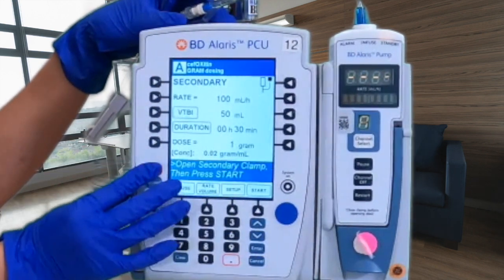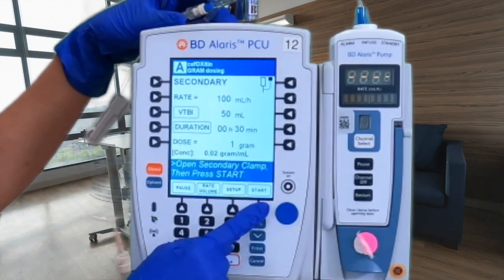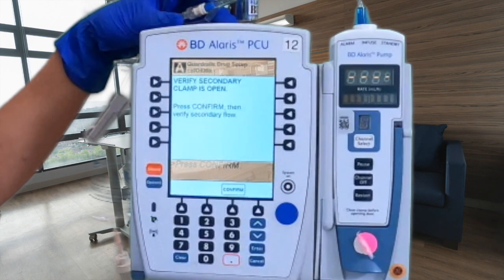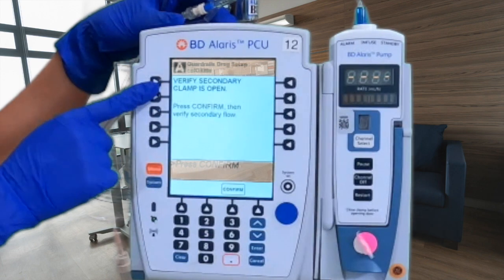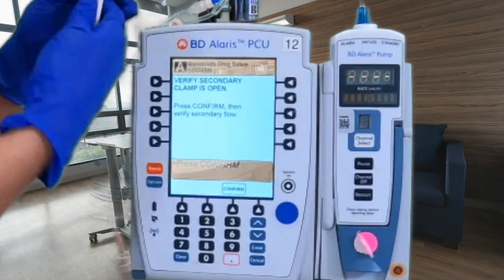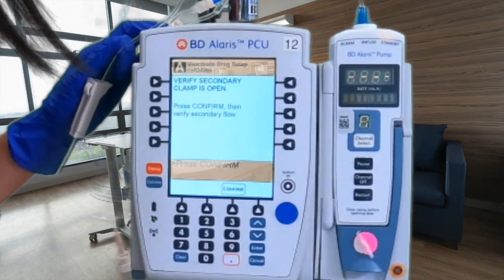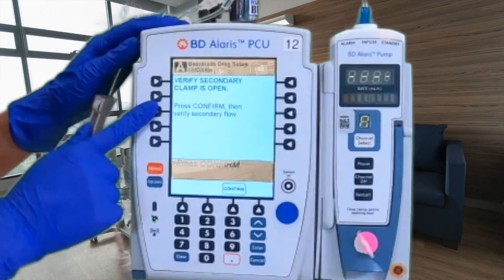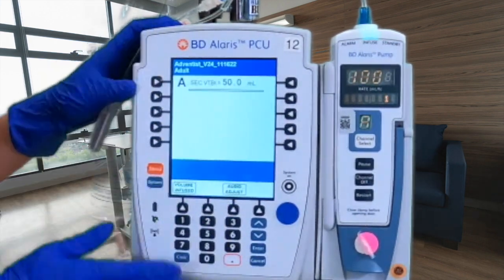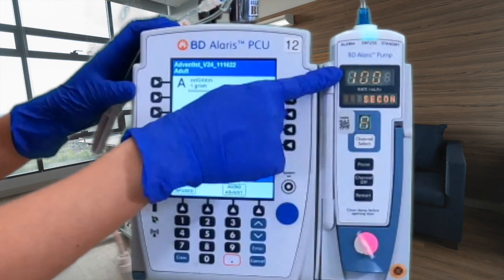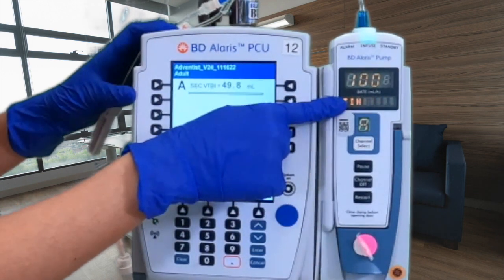Always make sure the order makes sense: correct volume to be infused, correct duration, and correct dose. Once you confirm everything is correct, press start. This is a great opportunity to verify all clamps are open — unclamp your secondary tubing as well as the primary tubing at the bottom. Once done, press confirm and you should be ready to go. You'll see the rate is 100 mL/hr and it will display cefoxitin on screen.